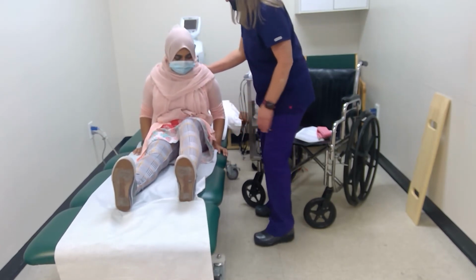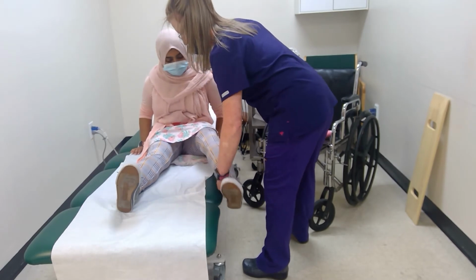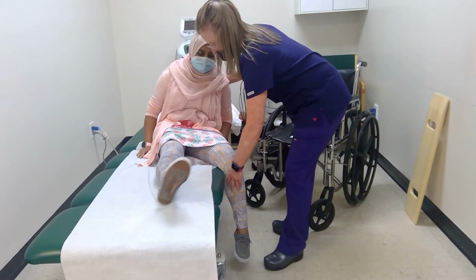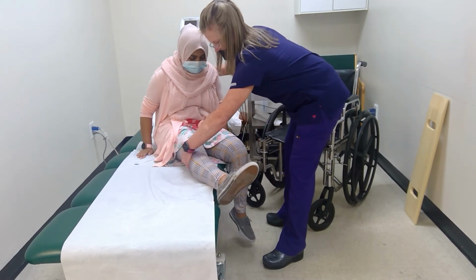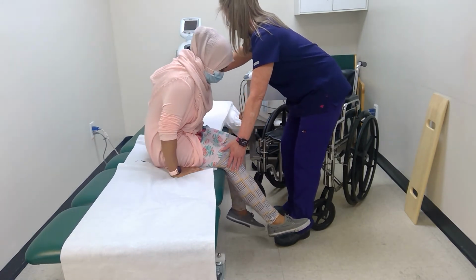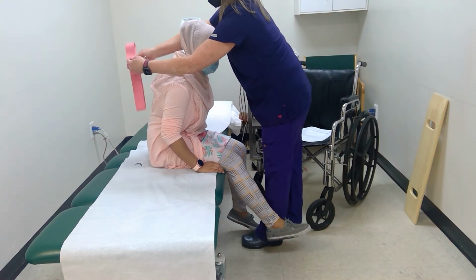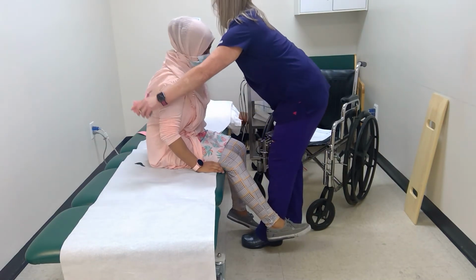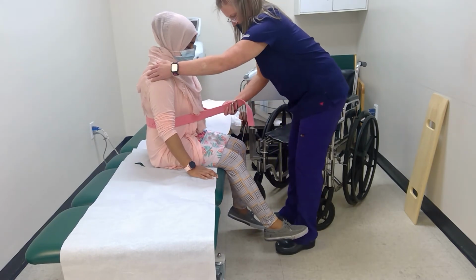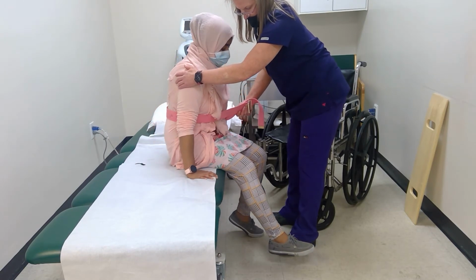Very good. Okay, now I'm going to help you bring your legs over very slowly. Go ahead. Very good. And let that go. Okay, all right, now that we're sitting at the edge of the bed, I'm going to go ahead and put a gait belt on you. Go ahead and scoot all the way to the edge of the bed so that your feet are on the floor. There you go. Thank you.